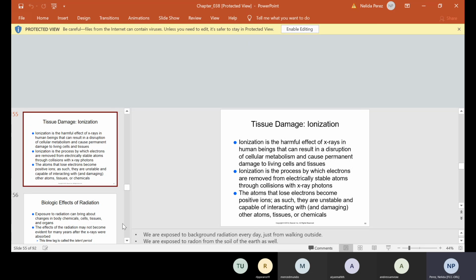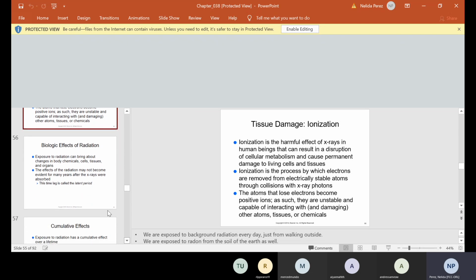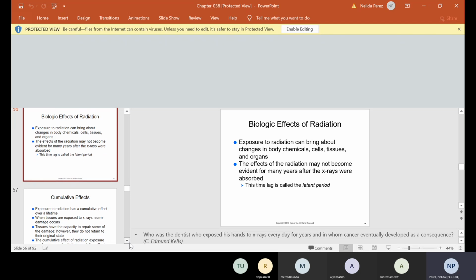So, again, you have to have a good comeback when the patients are complaining about 18 x-rays, because you're going to hear it. Another x-ray, if you guys don't have the answers, they're going to eat you up alive. Best comeback: you get more radiation walking to your car. Exactly. From the sun. Or standing in front of the microwave. Okay. That's why it has a timer. Walk away. All right.